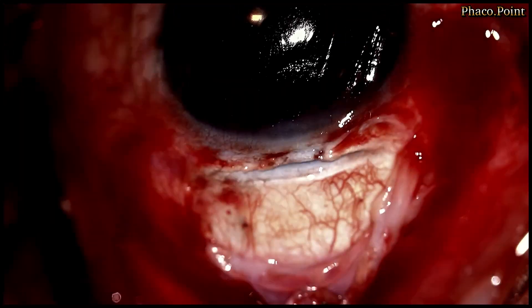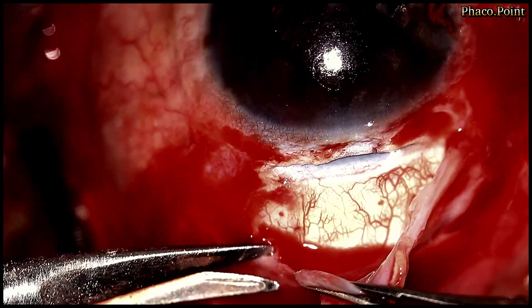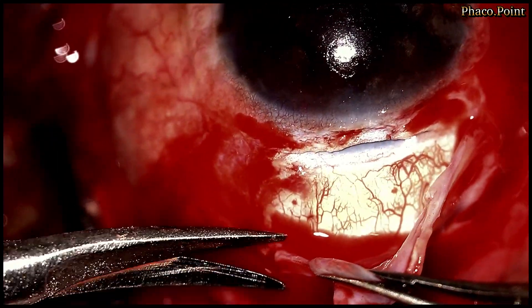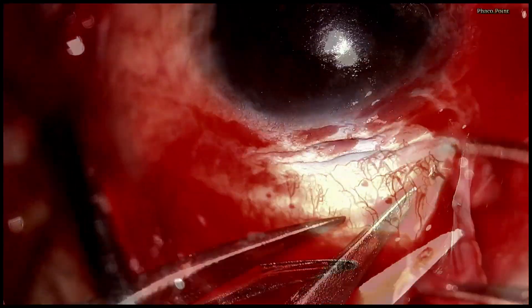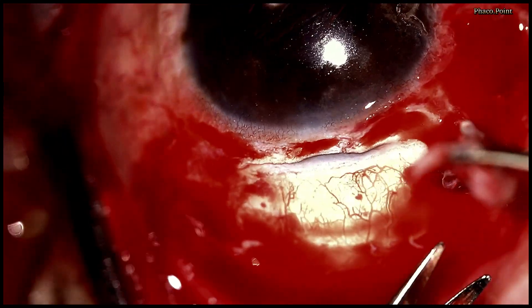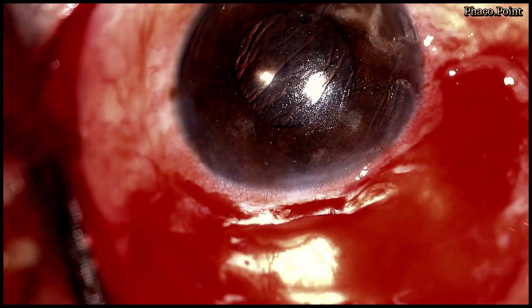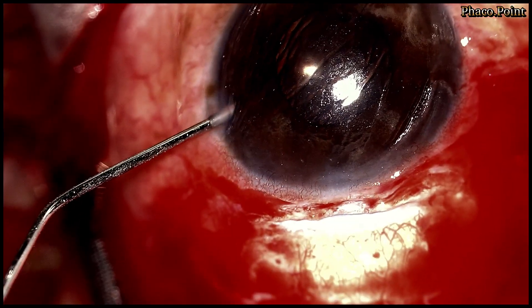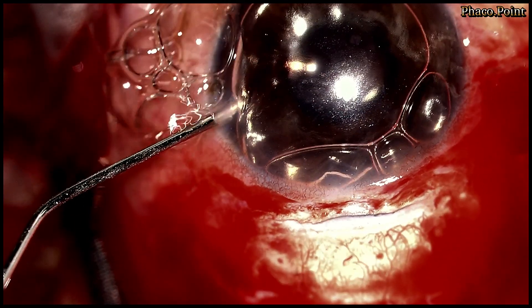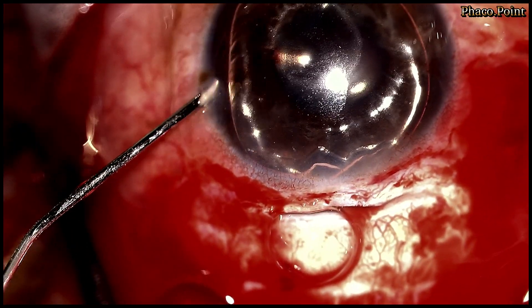The main SICS wound is explored, and this is followed by the complete excision of the cyst wall. The anterior chamber is then reformed with the introduction of intracameral air.